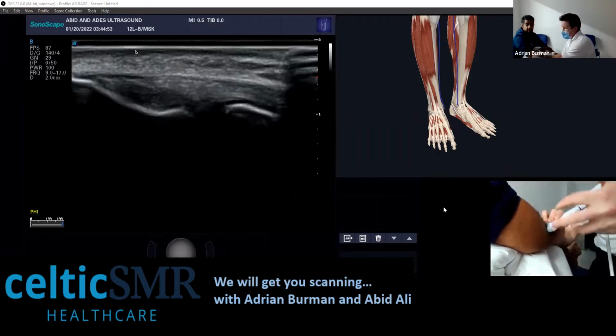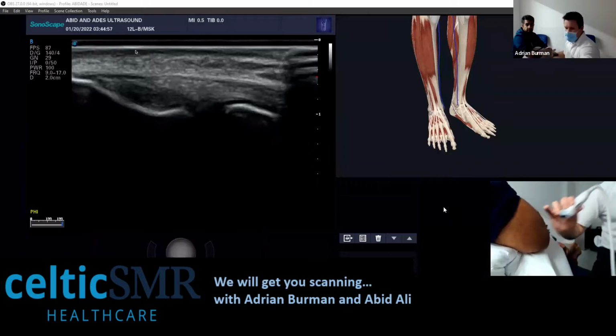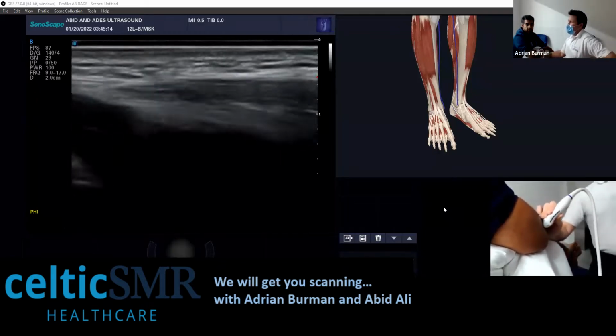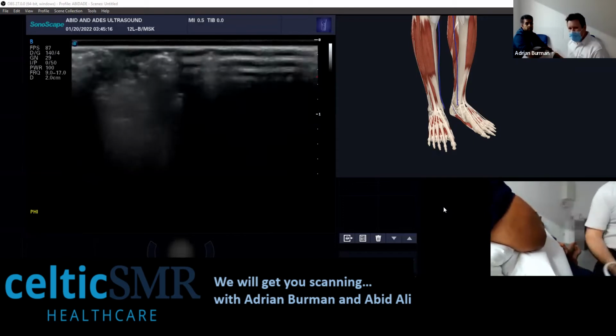It's quite difficult to get all those factors right here. If I was doing this in the hospital, I'd get the patient opposite, and I'd get them to put their arm relaxed on the table like that, and then I'd be able to steady my hand on the elbow. It's a little bit difficult here, but I'm just doing it to show you. So always change the position of your patient when you're scanning.